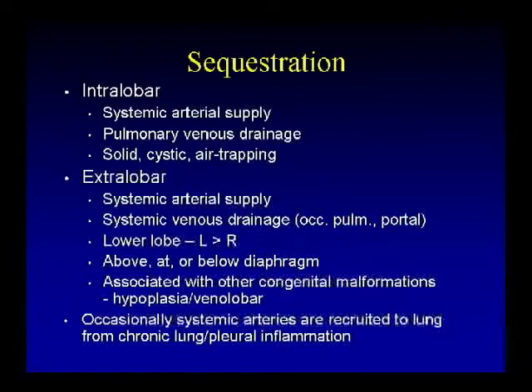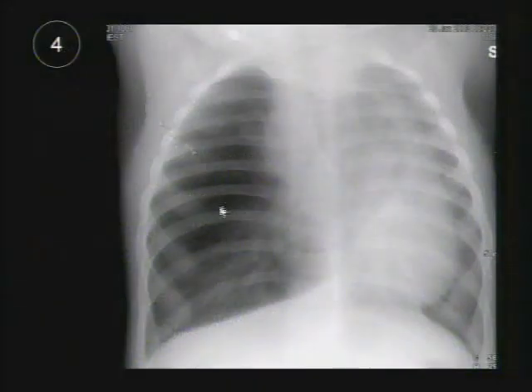Again, sequestration is important to understand. In the interest of time, I won't read all this, it's in your handout, but to recognize the differences between intralobar and extralobar sequestration and their associations. Next, unknown from the beginning.